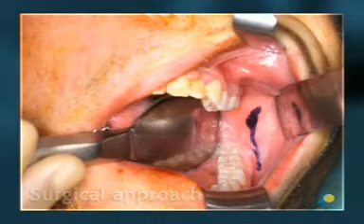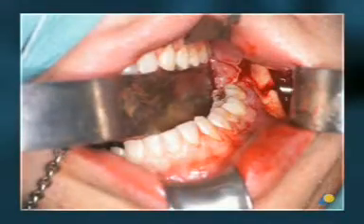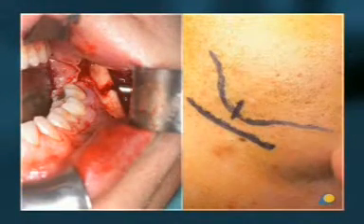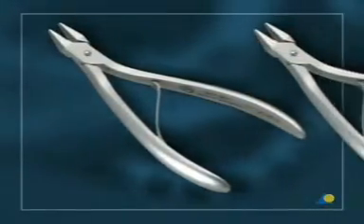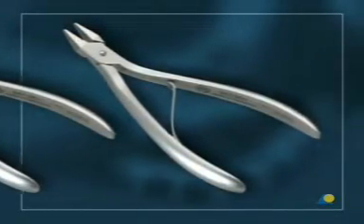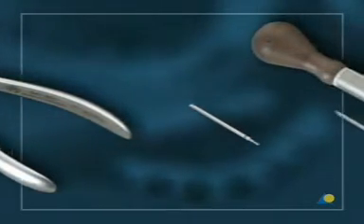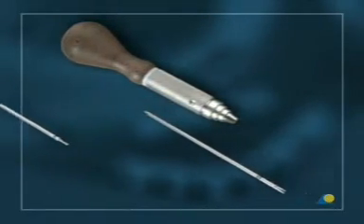The surgical approach can consist of an oral approach with the assistance of transbuccal instrumentation, an external approach, or a combination of an oral and an external approach. The instruments needed for the mandible mini plate are 2 bending pliers, the 1.5 millimeter drill bit with a 6 millimeter stop, and the 2.0 cruciform screwdriver shaft with handle.